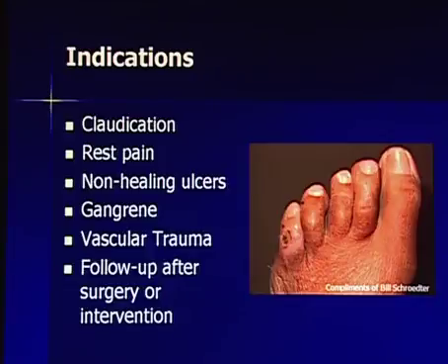Some people say that this pain wakes them up from sleep at night and is a burning sensation across their foot or ankle region. Sometimes we see patients with non-healing ulcers. In this diagram here, we can see this small non-healing ulcer on the toe here. Certainly the most severe case of arterial disease produces gangrene. Sometimes we see patients who may not have arterial disease in the common form of atherosclerosis, but may have arterial trauma, and we have to evaluate those patients. And certainly we use ultrasound in the follow-up treatment, either following intervention or surgery, to monitor these patients.